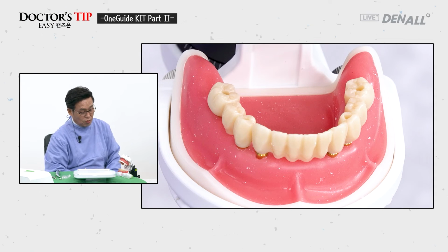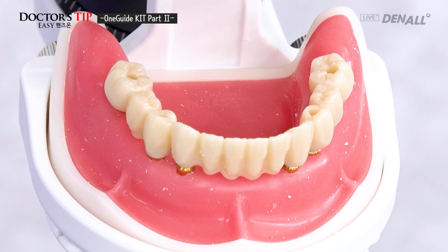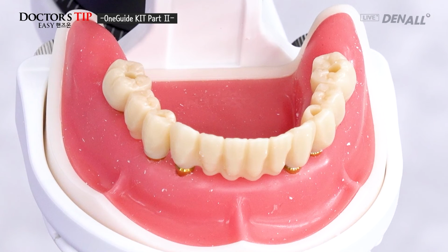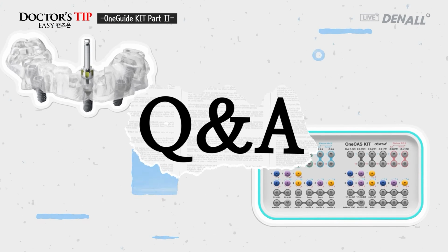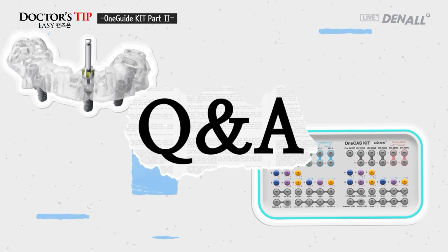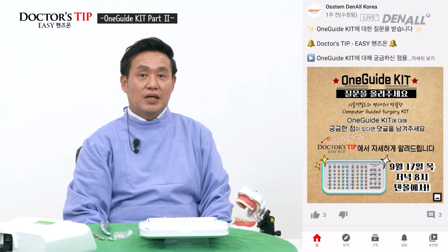Finally, abutment, we're going to tighten the torque, and cementation is going to be done, and they deliver temporary prosthesis, and everything is done. This has been today's hands-on. The hands-on practice is complete.